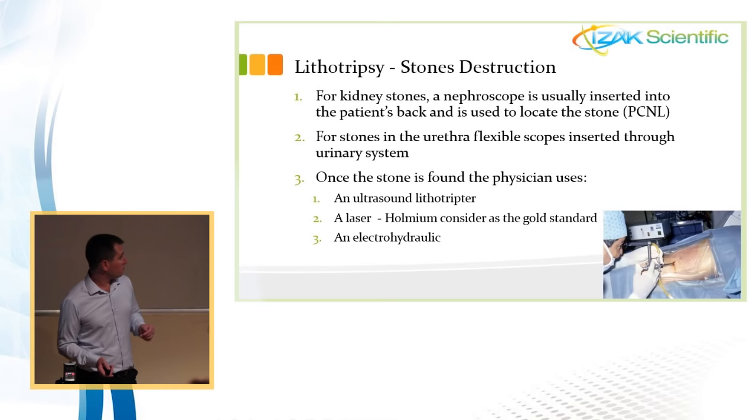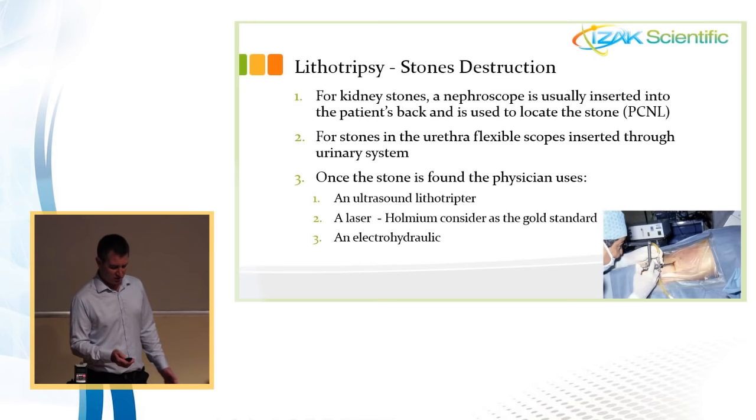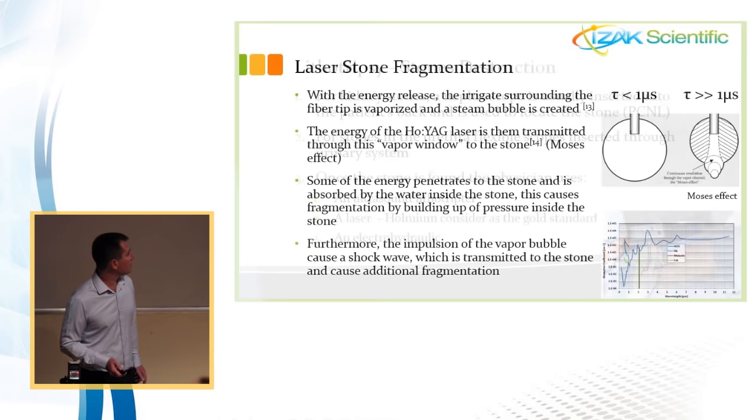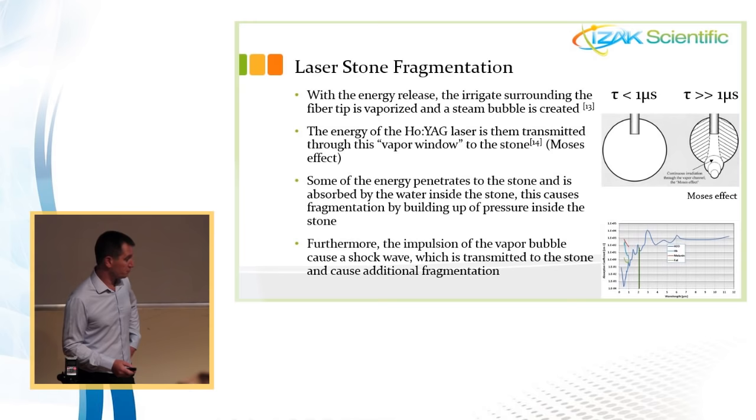Among the minimally invasive solutions, there is ultrasound, which is very popular, electro-hydraulic, and lasers. Among the lasers, the Holmium laser is the most popular, and actually it's the gold standard to use Holmium laser among the lasers for stone fragmentation. So how does it work? Here the mechanism is a bit different. It's a combination of photomechanical and photothermal phenomena.